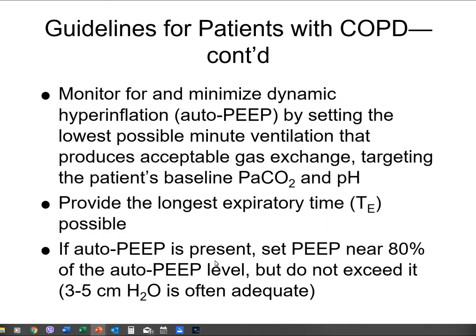Okay, so here we're talking about auto PEEPing. We want to watch for that, and remember, we watch for that with the expiratory hold button. You want to make sure that they are not auto PEEPing, or if they are, you may not even have to press the expiratory hold button. You'll probably see it on your volume scaler. They're still going to be retaining volume, so therefore they're trapping. So again, provide the longest expiratory time. We've talked about that time and time again for the COPDers. You want a lot more expiratory time to blow off that excess CO2.